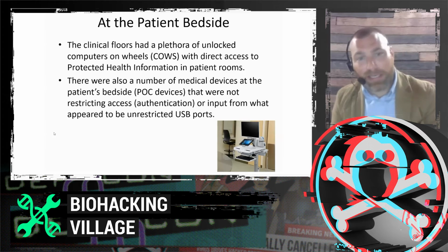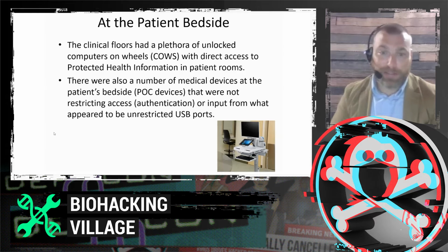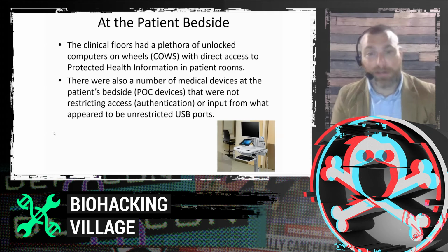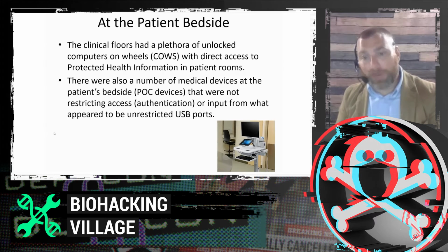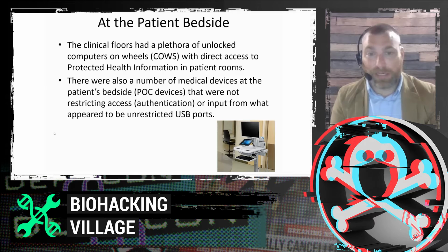At the patient's bedside, as anyone who has visited someone in a hospital knows, especially in a critical case, the patient is surrounded by a number of different medical devices. Many of those devices, such as a COW, or computer on wheels, are where the nurse or clinical staff sit down and do their documentation. They do vital signs, ask the patient all their questions, then go to this computer to write notes. Typically, from what I've seen, most of these were not locked down, at least in the hospital that I was in. And I've installed medical software in a previous role, and that's certainly not always the case.